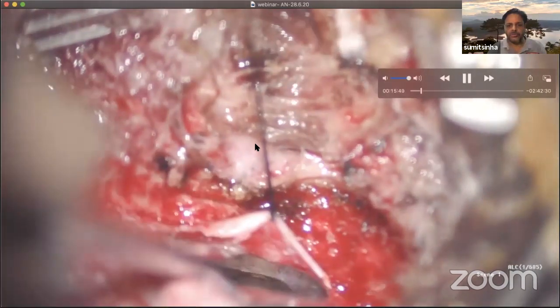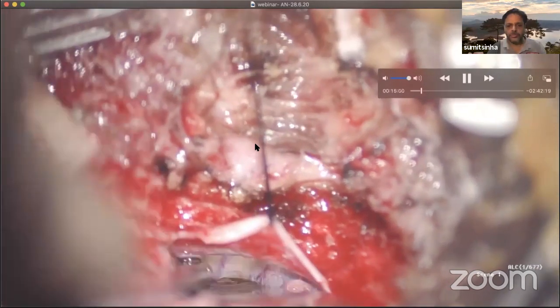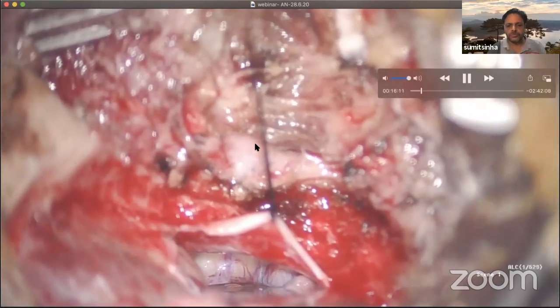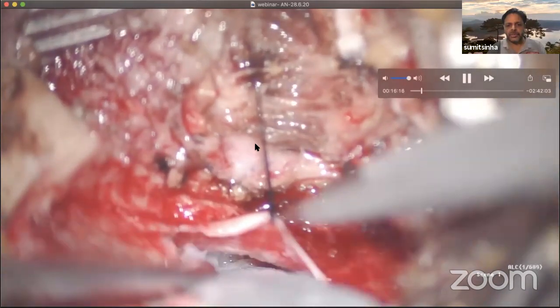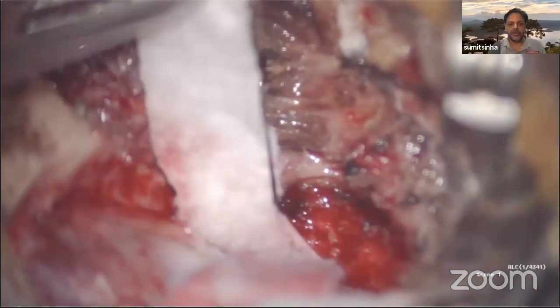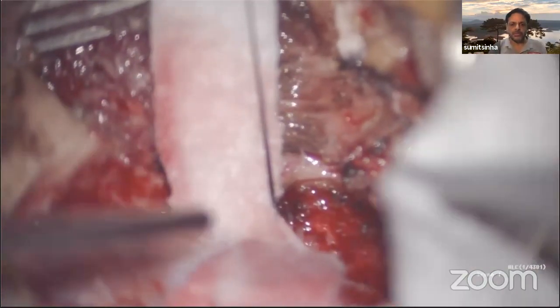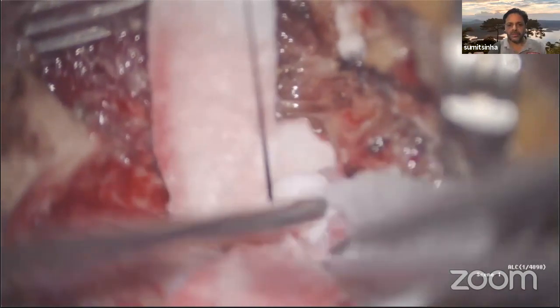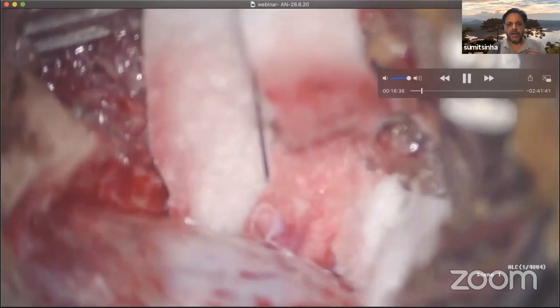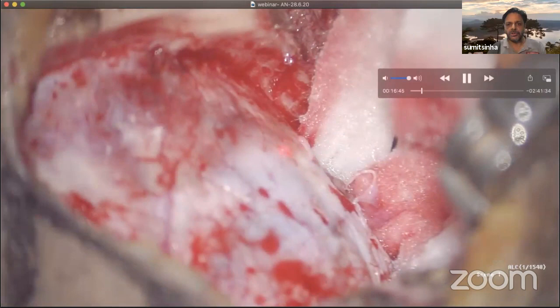And some more CSF coming from the cisterna magna there. At the end, what you do is you leave a cotton patty wick, as I call it, and then it keeps on draining the CSF throughout the surgical procedure. You leave it as such for the whole length of the surgery. So the first step of the surgery after opening the dura is complete now, and you are ready to open the rest of the dura.